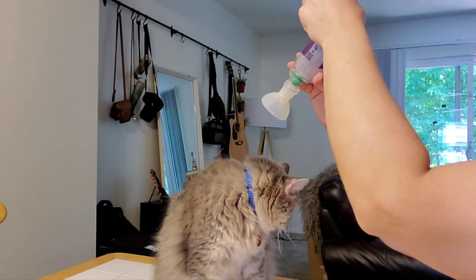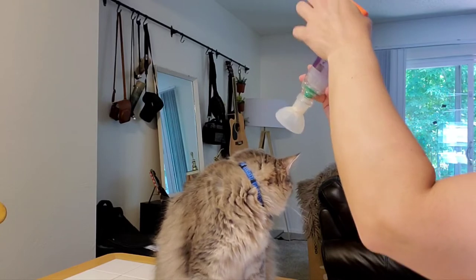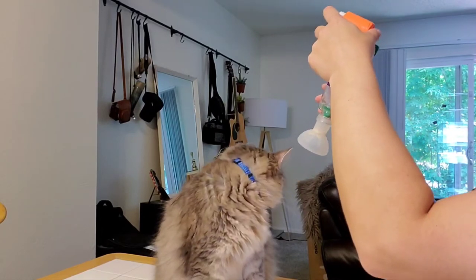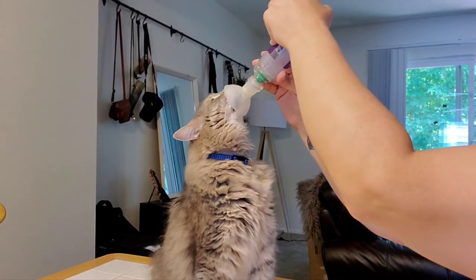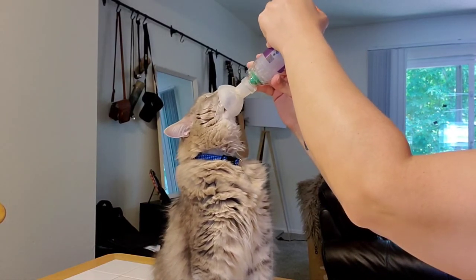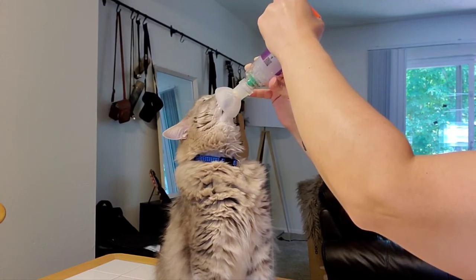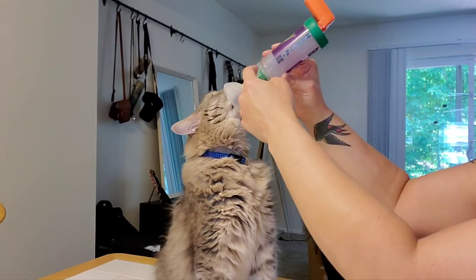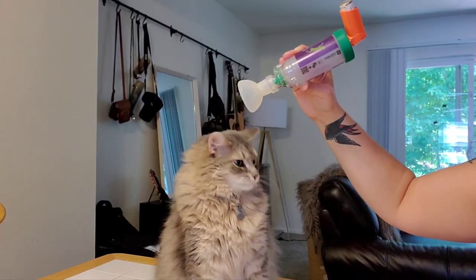He pulls his head away because I really glob it in there. Good boy. I'm applying slight pressure and I'm just going to get a good squeeze in there. You can't see it really well, but there's a little valve up here and it's flapping back and forth as he breathes.